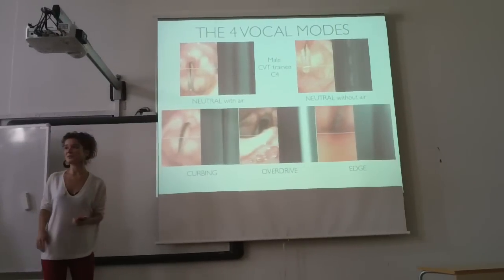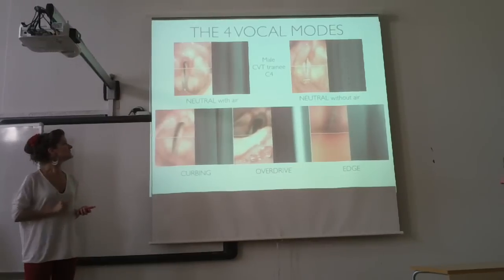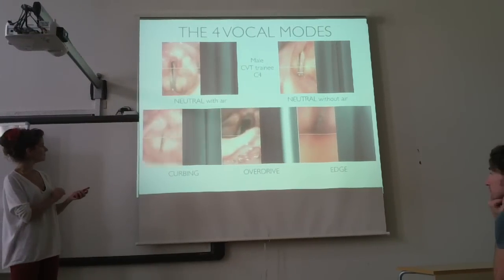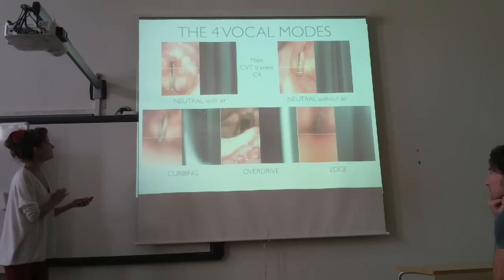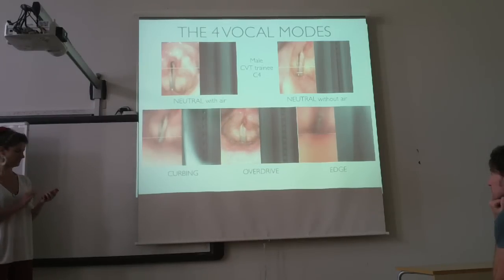So, this was neutral with air. The next one is neutral without air. Then we have curbing. I'm not going to go further into that. That was overdrive. And edge.